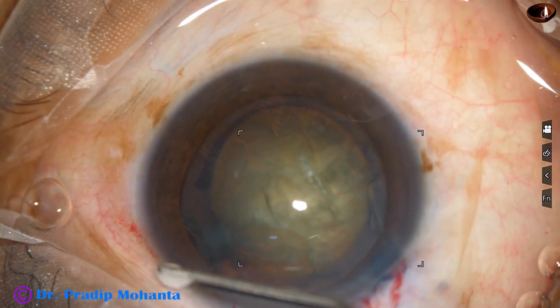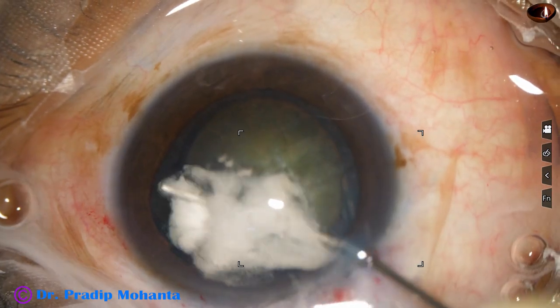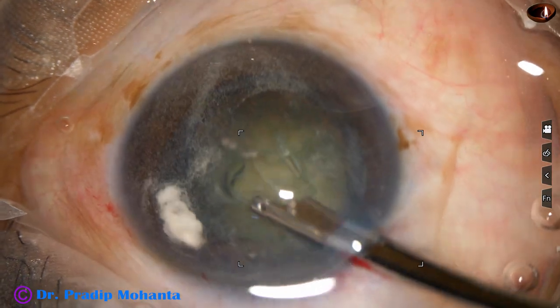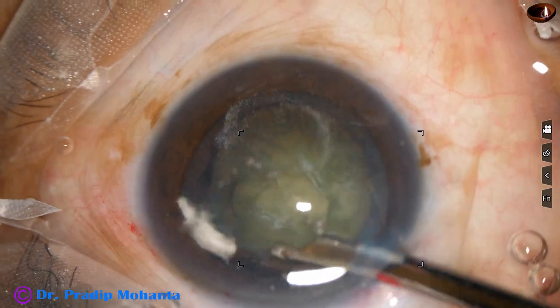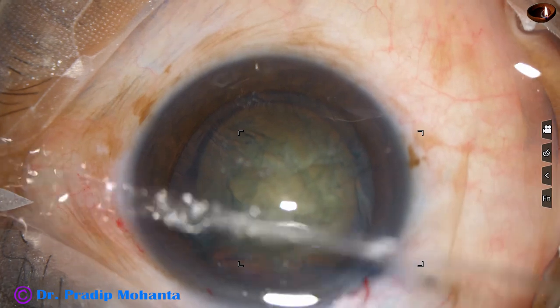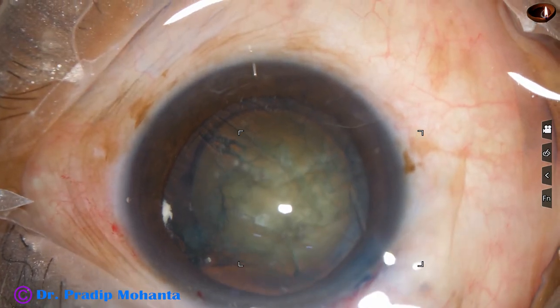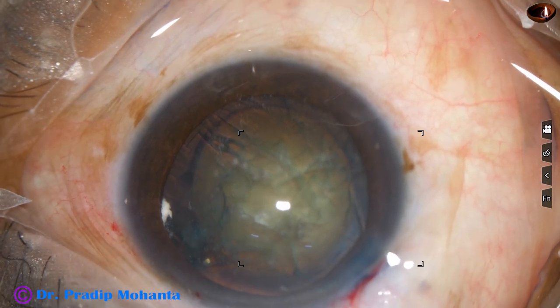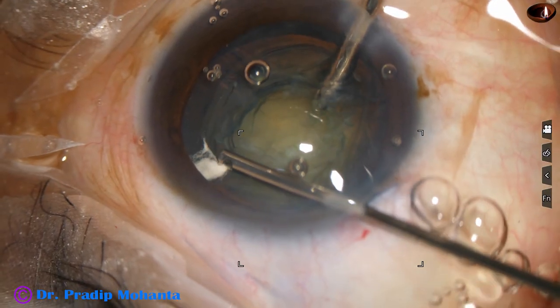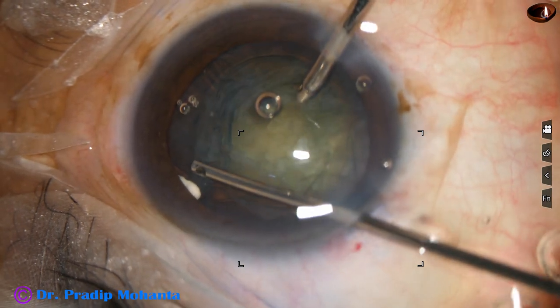I am thinking about what to do. I tried to aspirate some cortex and asked for triamcinolone acetonide. As I wash the triamcinolone, I find there are vitreous strands at 2 o'clock. As I form the anterior chamber it goes behind, and as I press over the lens surface it comes anteriorly. So I take a vitrectomy cutter and shave this.